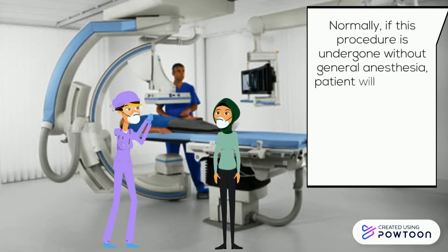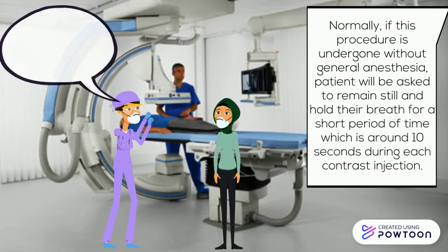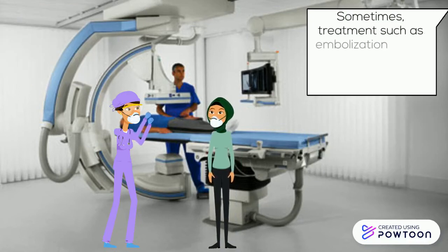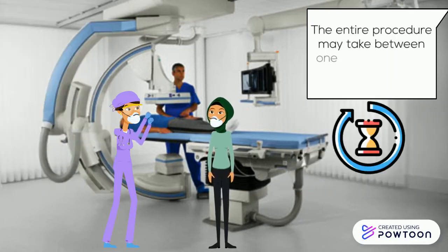Normally, if this procedure is undergone without general anesthesia, the patient will be asked to remain still and hold their breath for a short period of time, which is around 10 seconds during each contrast injection. Sometimes, treatment such as embolization will be carried out following diagnosis if necessary. The entire procedure may take between 1 hour to several hours.